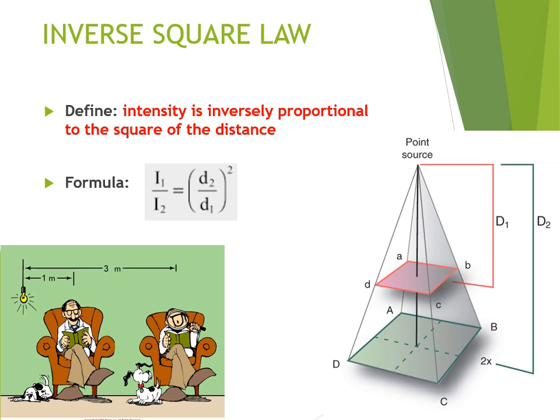So as you increase distance, we decrease radiation intensity. That makes distance our best friend in radiology. We're going to decrease intensity by a squared effect, which is really important for us. That's why distance is the most important cardinal principle.